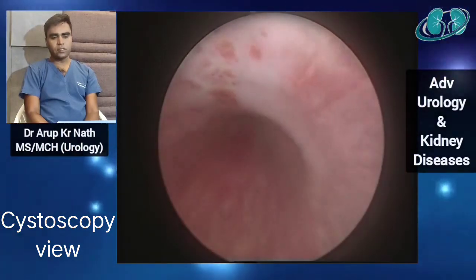That concludes the cystoscopy in this patient. So this is a beautiful endoscopic technique to see inside the urethra and inside the urinary bladder for presence of any tumor, stone, infection, inflammation, diverticula, or narrowing of the urethra. It can be done under local, spinal, or general anesthesia, using a flexible or rigid cystoscope. Thank you.